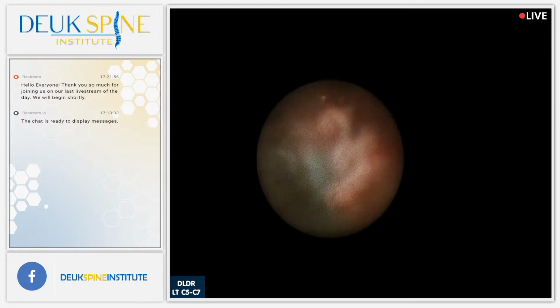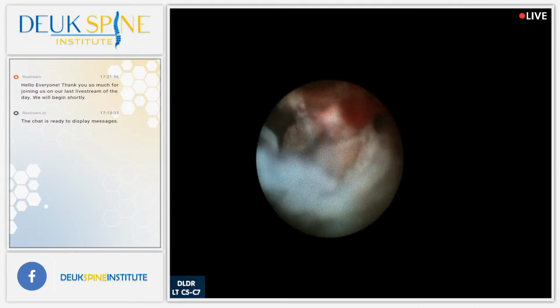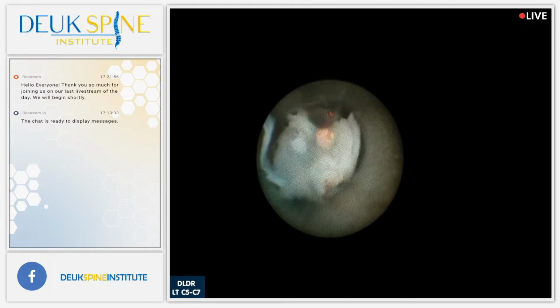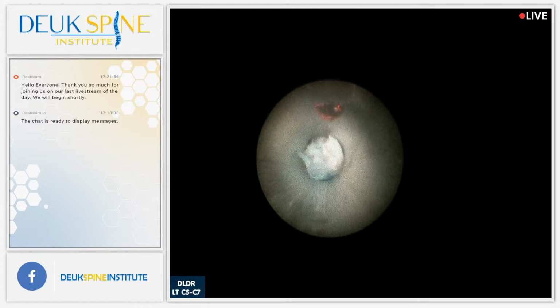Too slow. Way too slow. Let me know when you're ready. That's better. Stop, please. Thank you. What is it with big-chested people today?